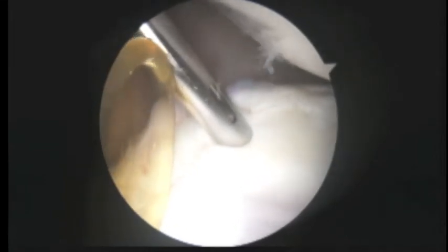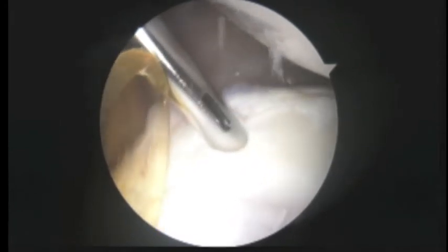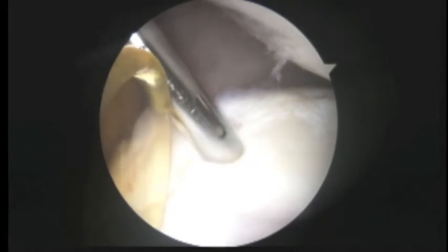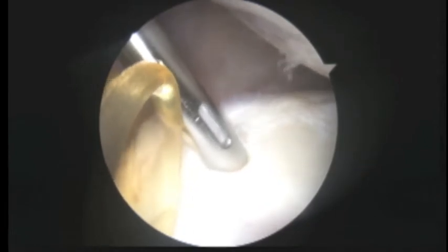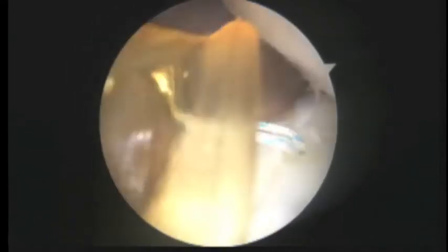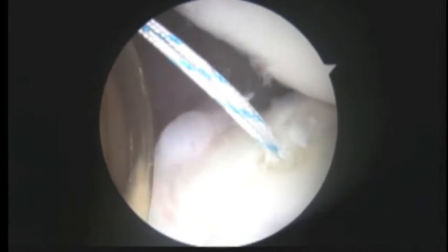And the next step is to go ahead and take a drill. Drill straight down into the bone here. There's the anchor. And there's the suture. And I'll give a tug on the sutures to seat the anchor. And that feels very solid. So next we'll go ahead and take out one of the sutures here.